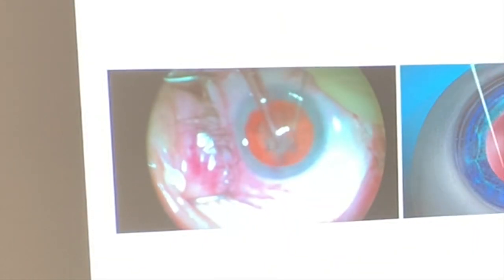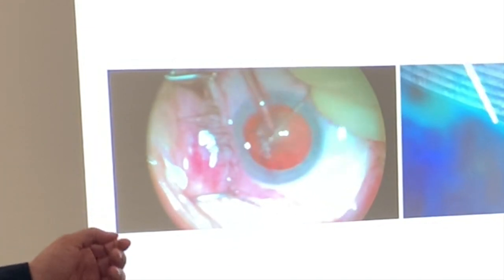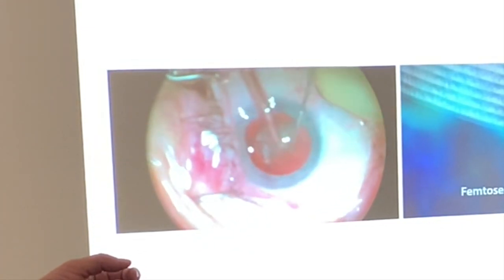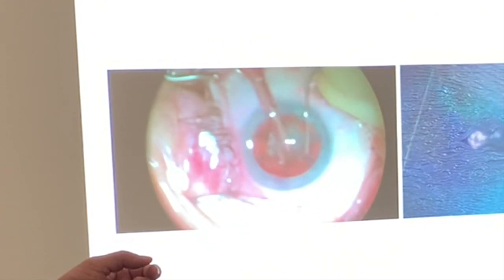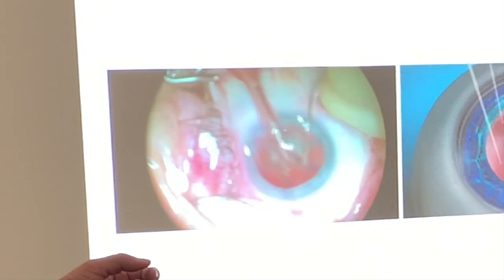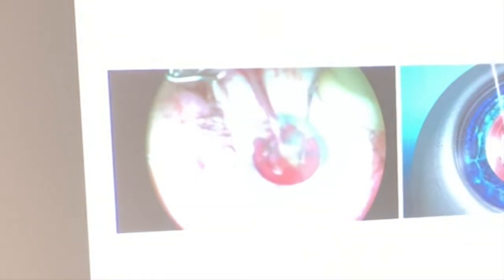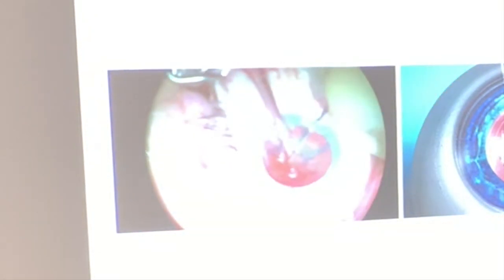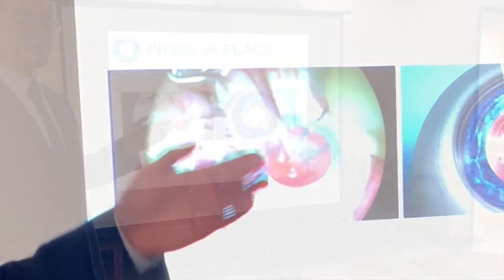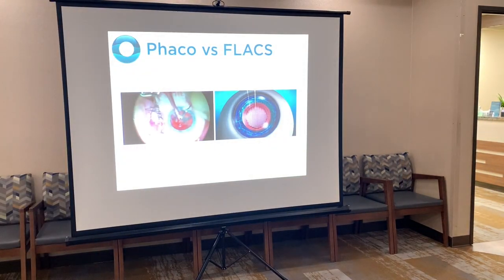So on the left, you'll see that's my video. We are using our hands to break it up one by one by one. And now that one, it's great. I have six tiny pieces I can now remove sequentially. So it's a pretty fast process. When you chop it, you don't have to create a slow trench. You can just snap through each of the pieces.